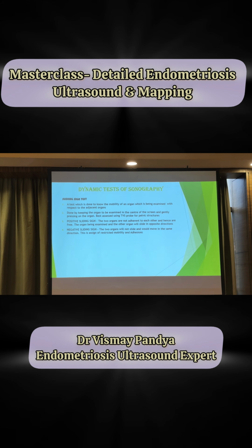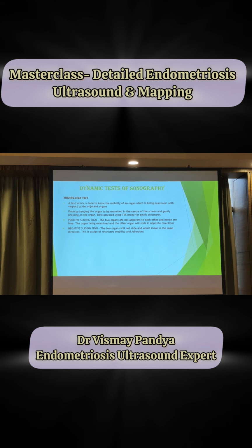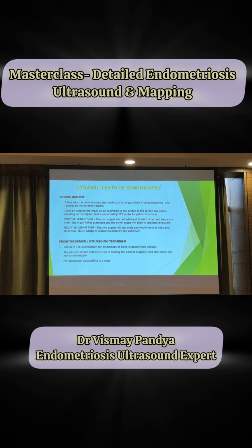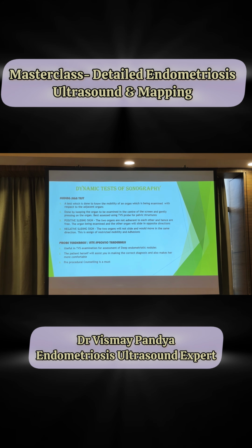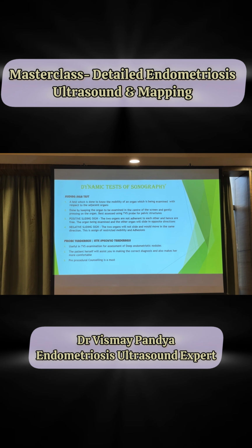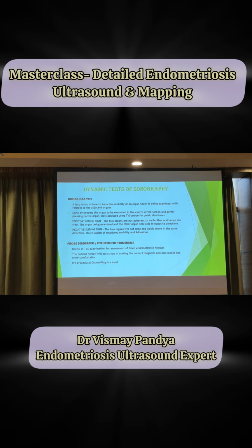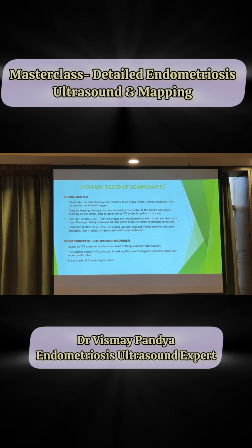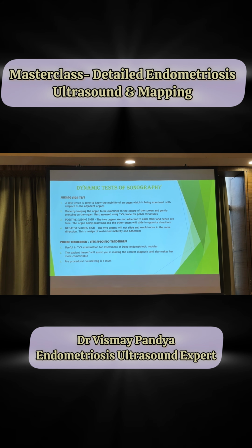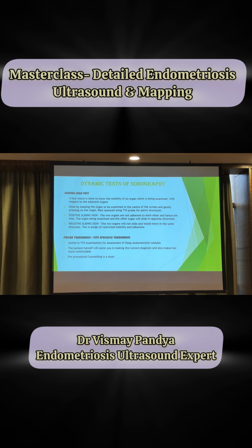The sliding test can be done on any two structures. It is not just of the uterus or the rectum. The other test is probe tenderness, or site-specific tenderness. These two tests make transvaginal sonography superior to an MRI, because this can't be done in an MRI. For probe tenderness, you put the probe in the fornix and tell the patient that you may feel some pain in the anterior or posterior fornix, and ask the patient to let you know where that pain is occurring, because if you locate that site, most probably that will be the point where the deep endometriosis is located.